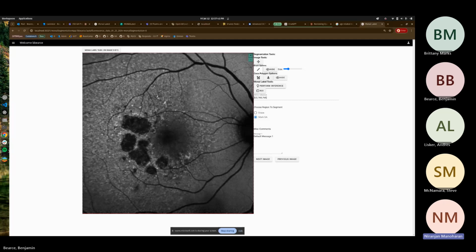It doesn't capture well, but you can see it a little bit in the top right part of the image, the central retinal artery. So a little bit more than 2 times that would be 250 microns. It's a good way clinically too: when you're looking for large drusen, if the drusen is larger than the size of the central retinal artery, that would be a large drusen, which is 125. And times 2 is 250. So lesions smaller than 2 times the size of the central retinal artery thickness, you don't necessarily have to annotate. All these little dots, you don't need to annotate. So that helps.